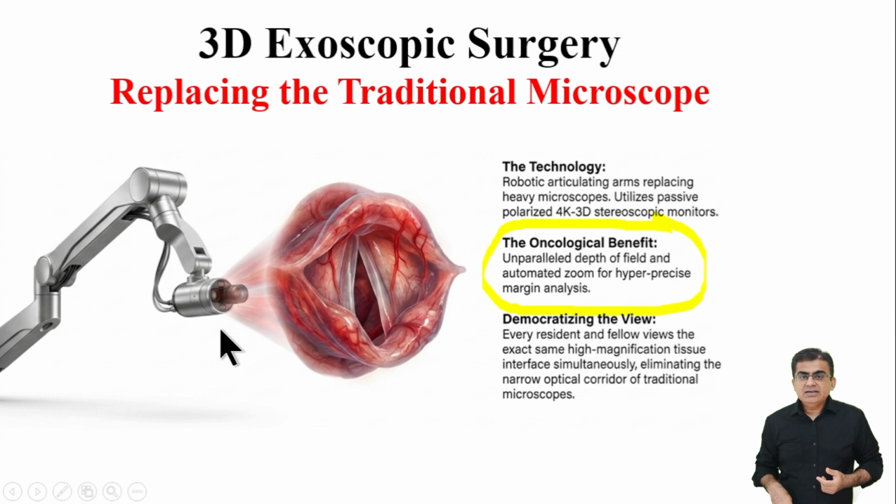Finally, look at the democratizing of the view. As academic teachers, this is perhaps the most exciting clinical benefit for our surgical training programs. In the past, only the primary surgeon could clearly see the delicate microscopic tissue details.